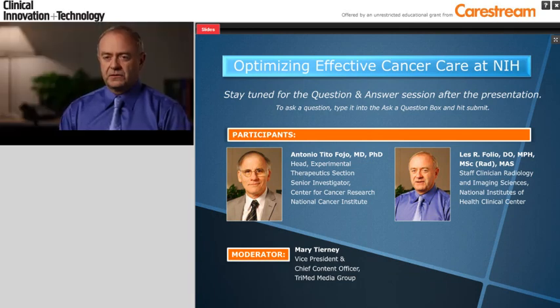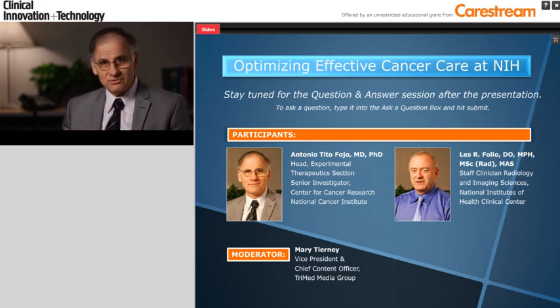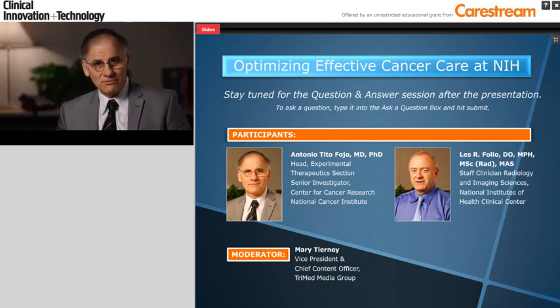Our conclusions in AJR were that the segmentation and the follow-up was more consistent, it was more accurate, and it saved time, cutting the time in half for the follow-up lesions. A radiologist doesn't want to spend a whole lot of time measuring a whole lot of lesions if it's not going to be of any value to the clinician. If that can be automated, if it can be made easier, if it can be made reproducible, if it can be made that it's used over and over again when the patient comes in for an evaluation, then that'll be much more valuable. And the practicing clinician then will have not this subjective assessment of what's happened to the lesion, but actually some hard numbers to really look at and make more informed decisions.